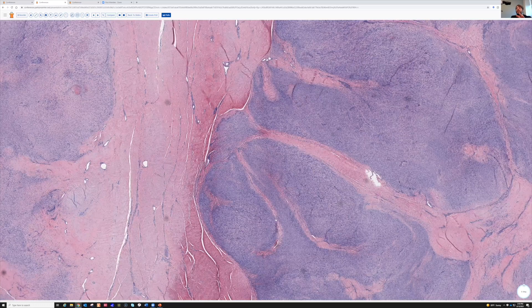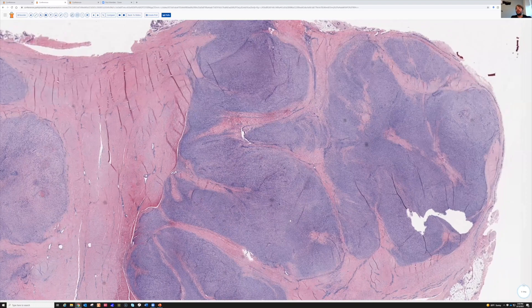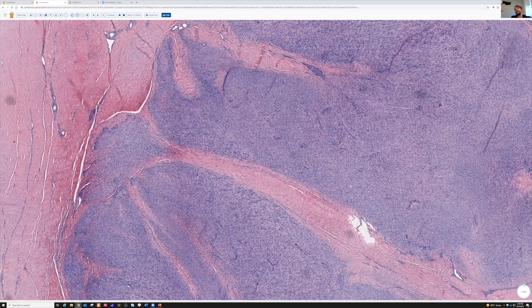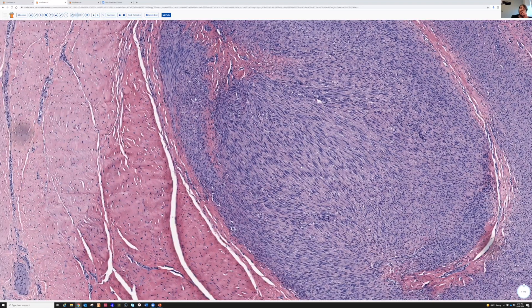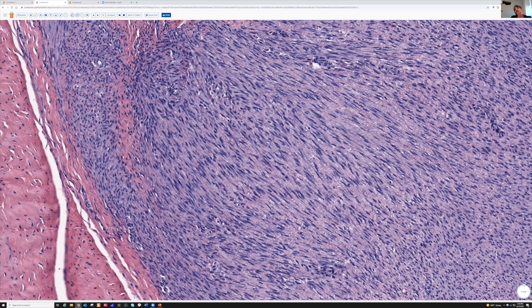It's arranged in kind of multiple nodules here. The spindle cells, even though they're a little hyperchromatic — I think part of that in this case was that we were having a little bit of trouble with the H&E and it was staining things a little darker — but aside from that, the cells are kind of monotonous and uniform.